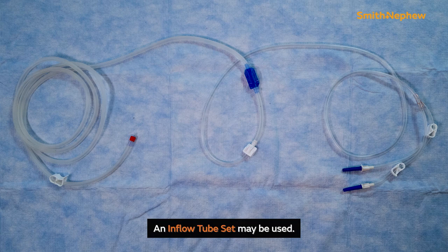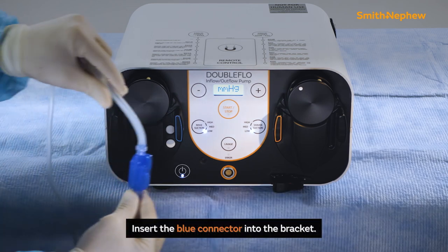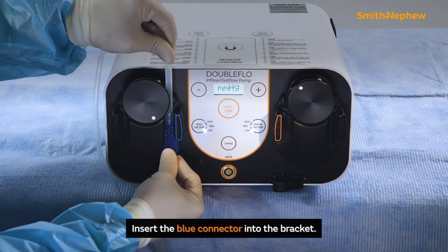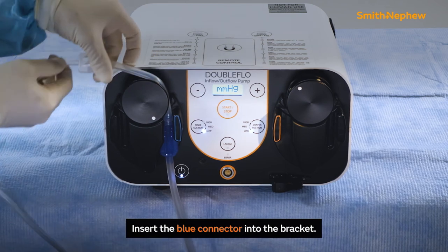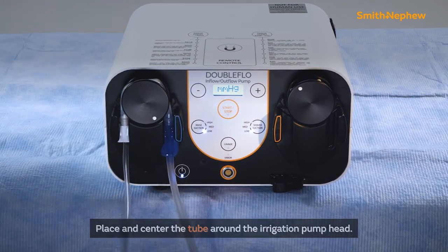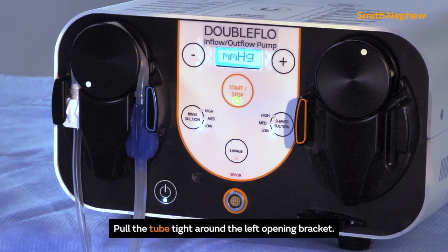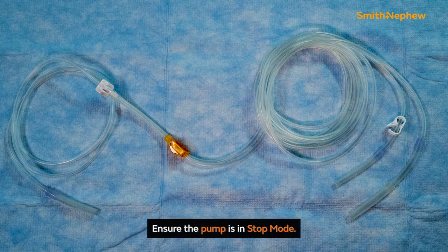The inflow tube set is for single use. Insert the blue connector into the bracket with the blue indicator of the irrigation side, while maintaining the blue connector vertically throughout insertion. Place and center the tube around the irrigation pump head. Pull the tube tight through the left opening of the black bracket for the irrigation side and insert the white connector into the black bracket of the irrigation side.